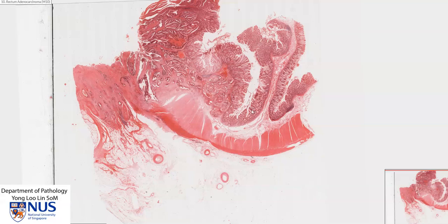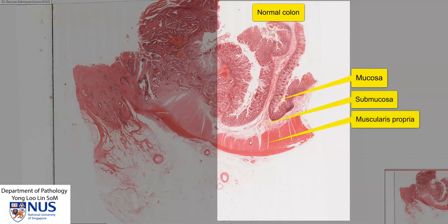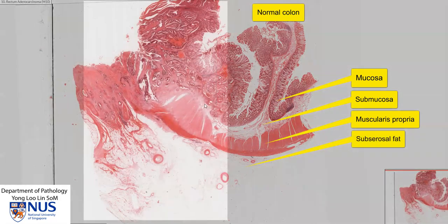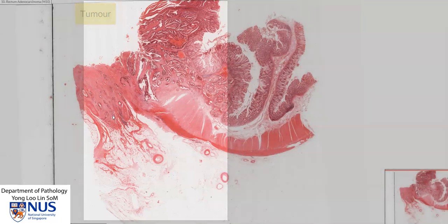This is a microscopic slide of a colon tumor. We can see the normal colonic mucosa, the submucosa, the muscularis propria with its two layers, and the subserosal fat. Starting from this highlighted point, this is where there is a tumor — an invasive tumor. The abnormal area invades all the way into the submucosa, through the muscularis propria, and even beyond into the subserosal tissue.